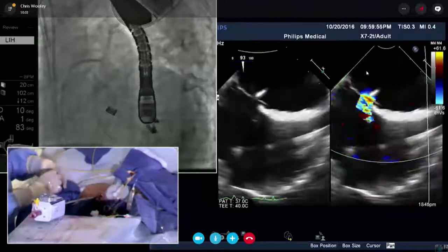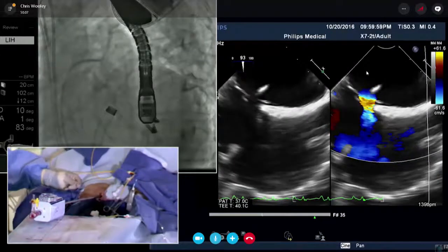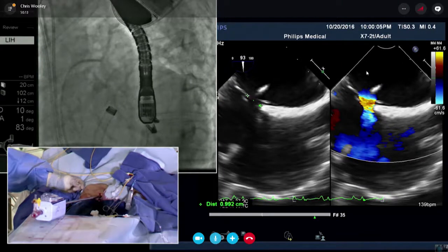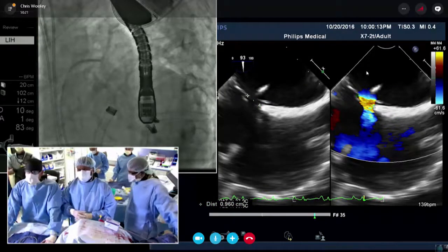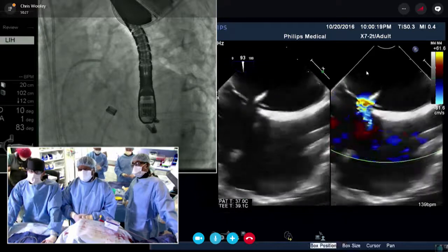And we'll decide whether we should do that. You already took a third clip out. But we didn't do that, right? Okay. It's almost 1 centimeter, 0.9 centimeters. So it's less than a centimeter. So we think we're just going to leave it alone. Can you do a short axis view of this hole? We don't often close those holes.